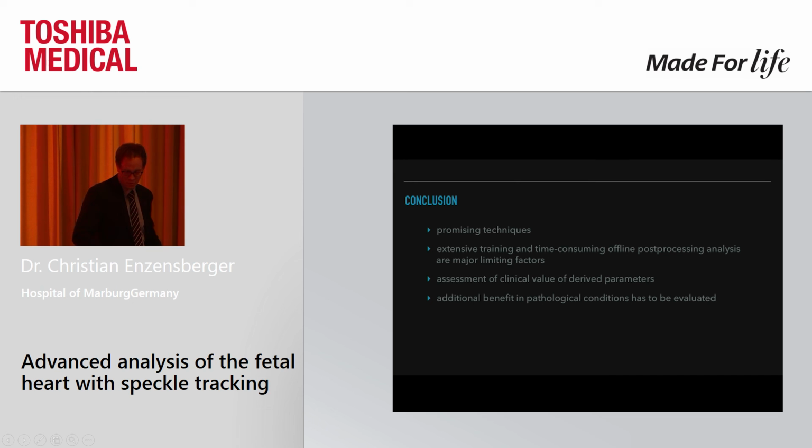It's a problem which all vendors have, and it's very interesting to see what technicians and engineers are able to produce, what you can measure, but we all have to ask ourselves about the clinical value of these derived parameters. And so the additional benefit in pathological conditions needs to be evaluated. Thank you very much.